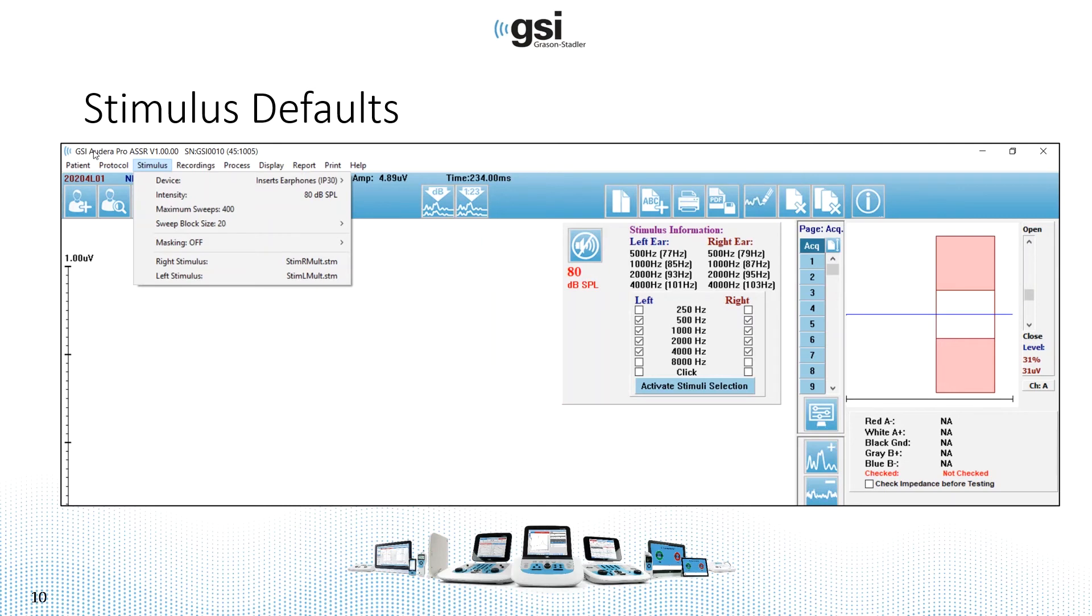There are a couple of other default settings for the stimulus. One is the maximum number of sweeps, which will be 400. So if a response is not detected, the test will automatically stop at 400.